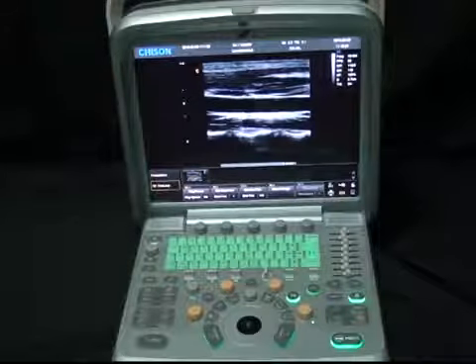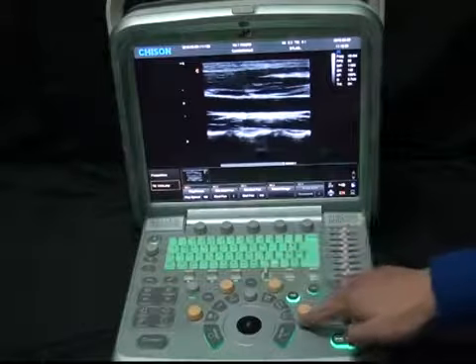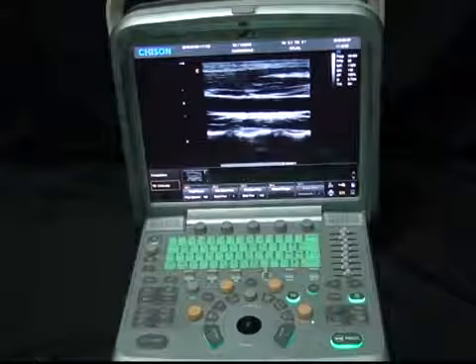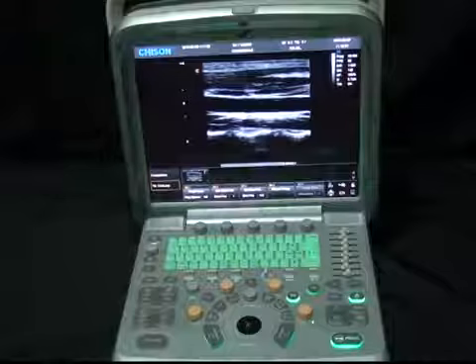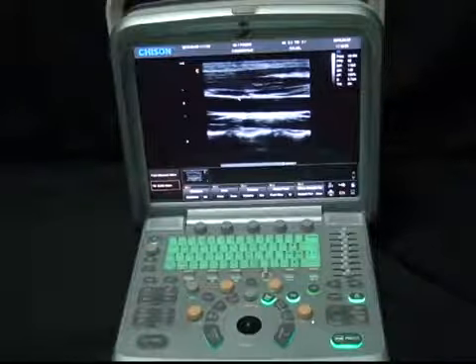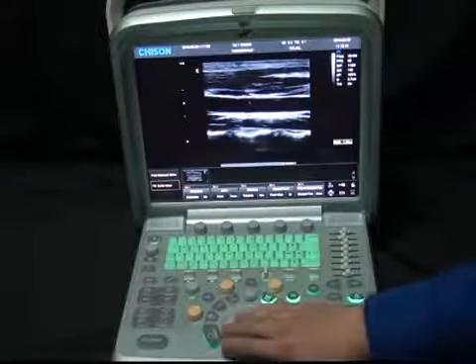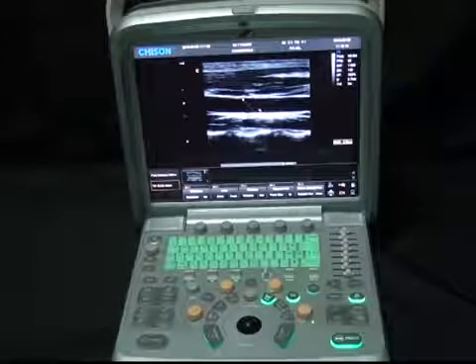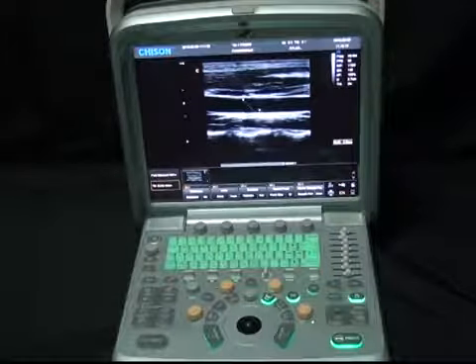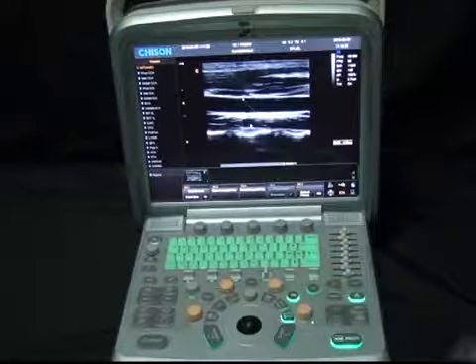Part 3: Measurement, Annotation, Bodymark, and Save. After getting a high-quality image, we need to do measurements. We have fast measurement and calculation package measurement. Let's take distance measurement as an example. Press the Dist button — you will see line segments on the interface. Press Update to change the active point, move the trackball, and press Enter to confirm. If you want to do professional measurement, hit the Calc button to open the calc package.